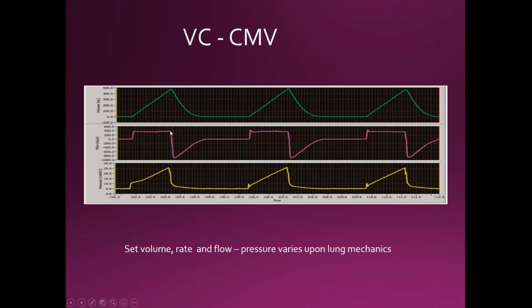And then when the flow stops, it drops down to 0, then my pressure starts going down and my volume starts going down. All right, so all of these three graphs are being recorded over time. Okay, so this is up to the minute breathing in terms of your volume, flow, and pressure.